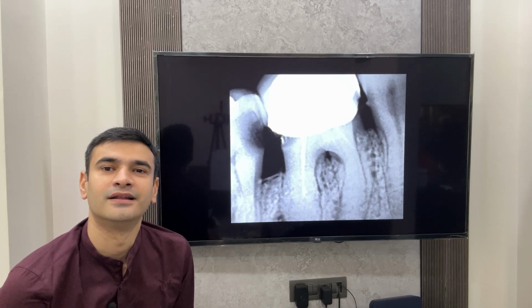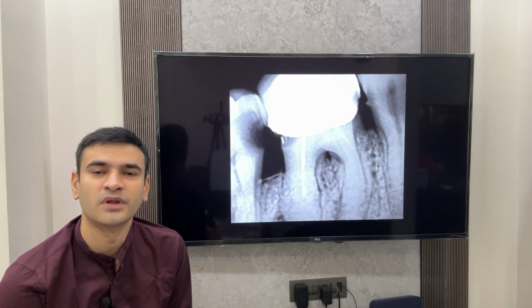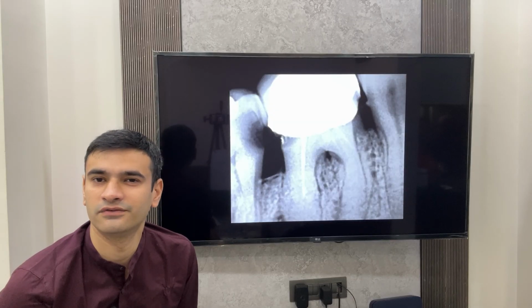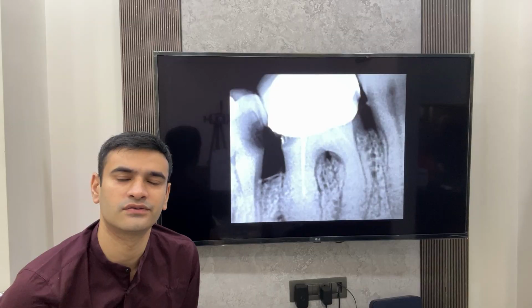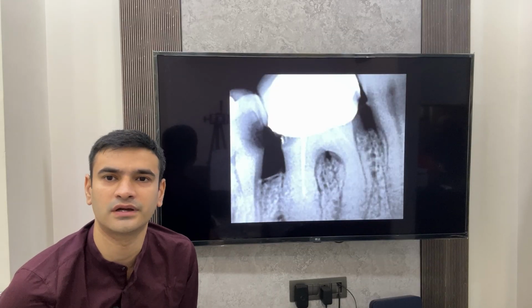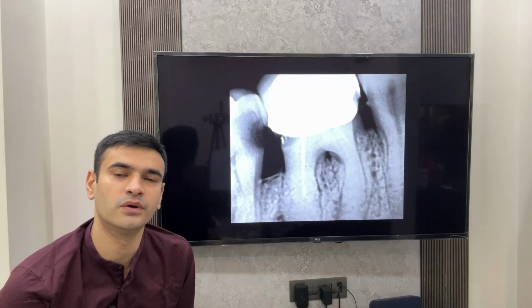Hi, this video is for retreatment or repeat RCT. Now, repeat RCT is very difficult. I believe that a repeat root canal case is at least 3 to 4 times more difficult than a normal routine case. I'll be making this video in two parts.